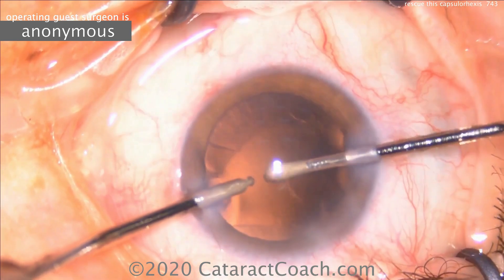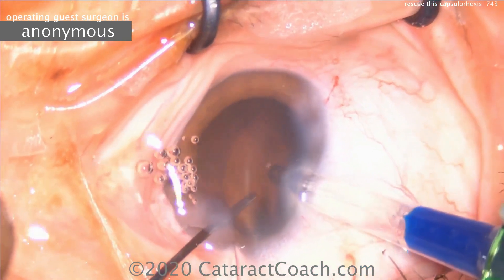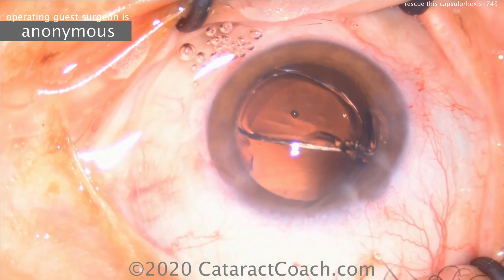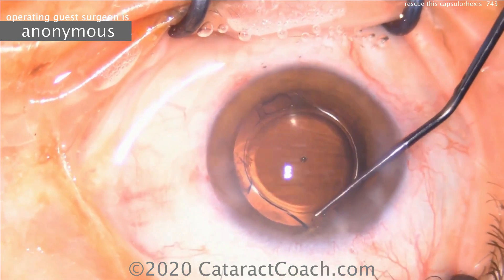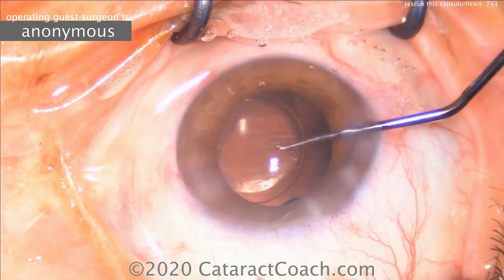Important not to let the anterior chamber collapse. If you let it collapse, you can have radialization of that lens tear on the capsule, and it can affect the posterior capsule. Here's a single-piece acrylic lens going into the capsular bag. Another appropriate option would be a three-piece lens in the bag or in the sulcus.